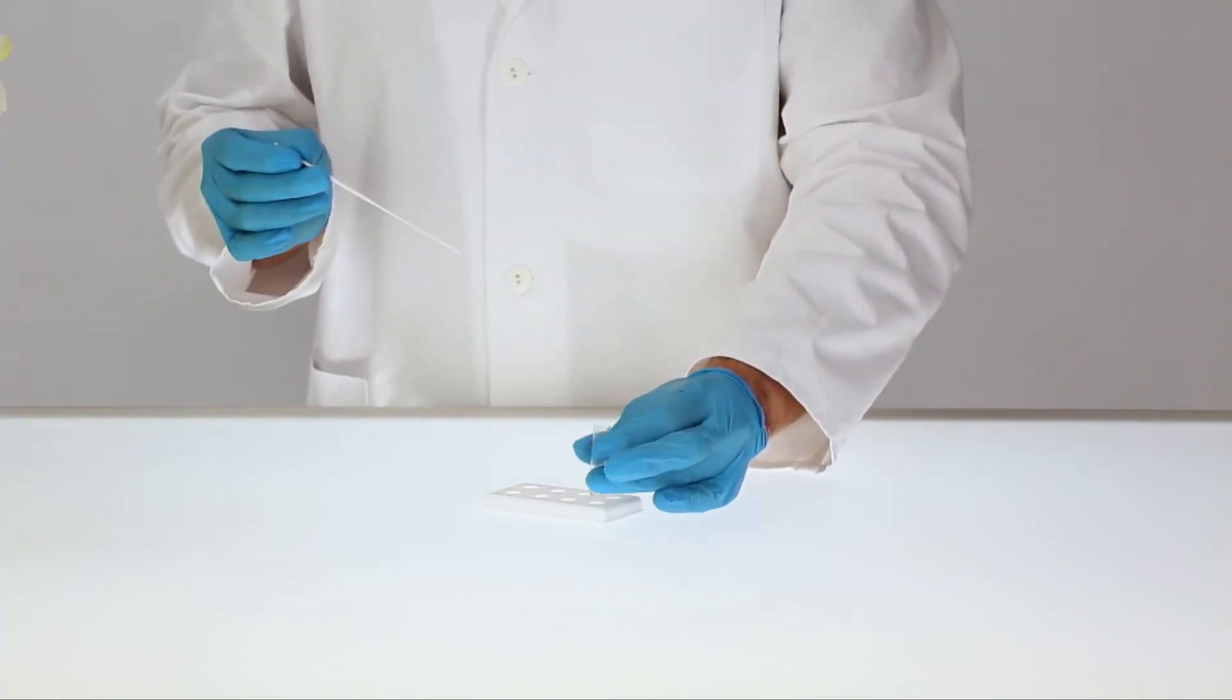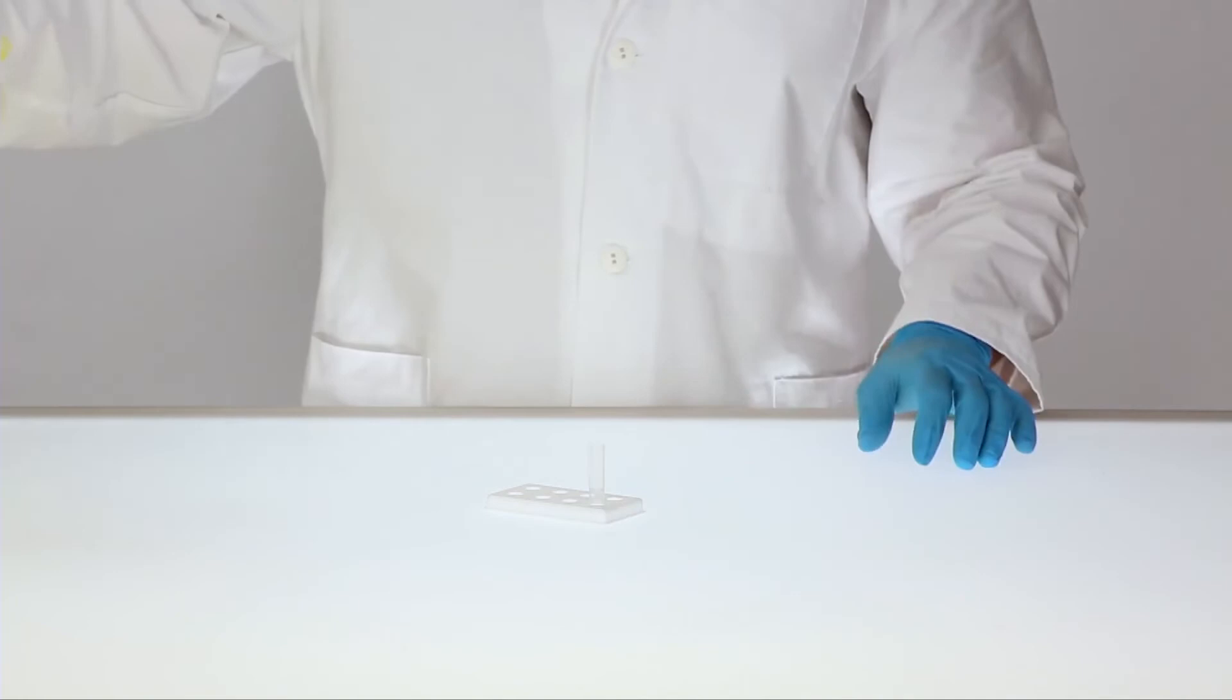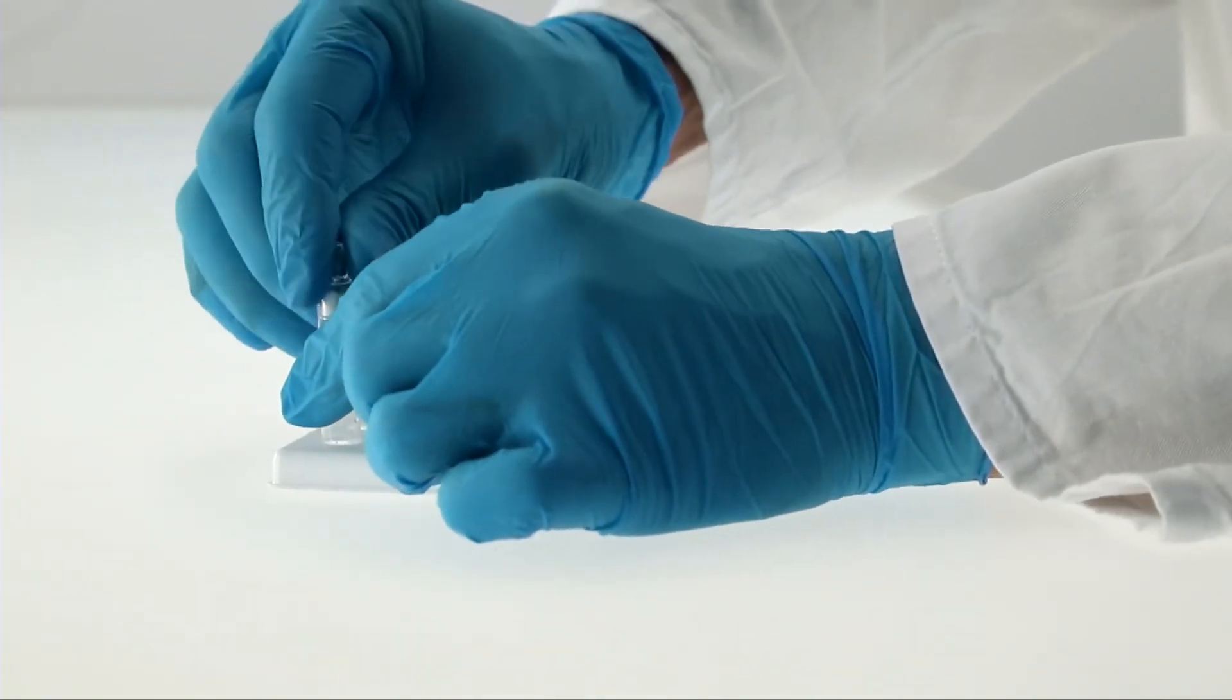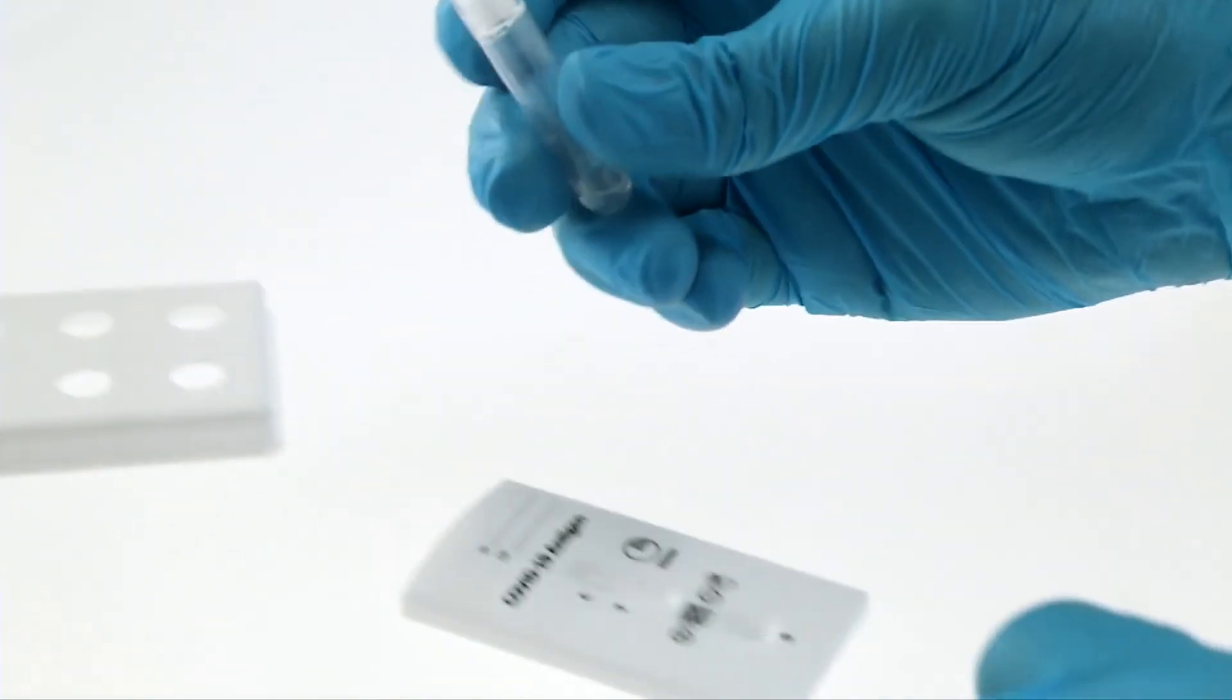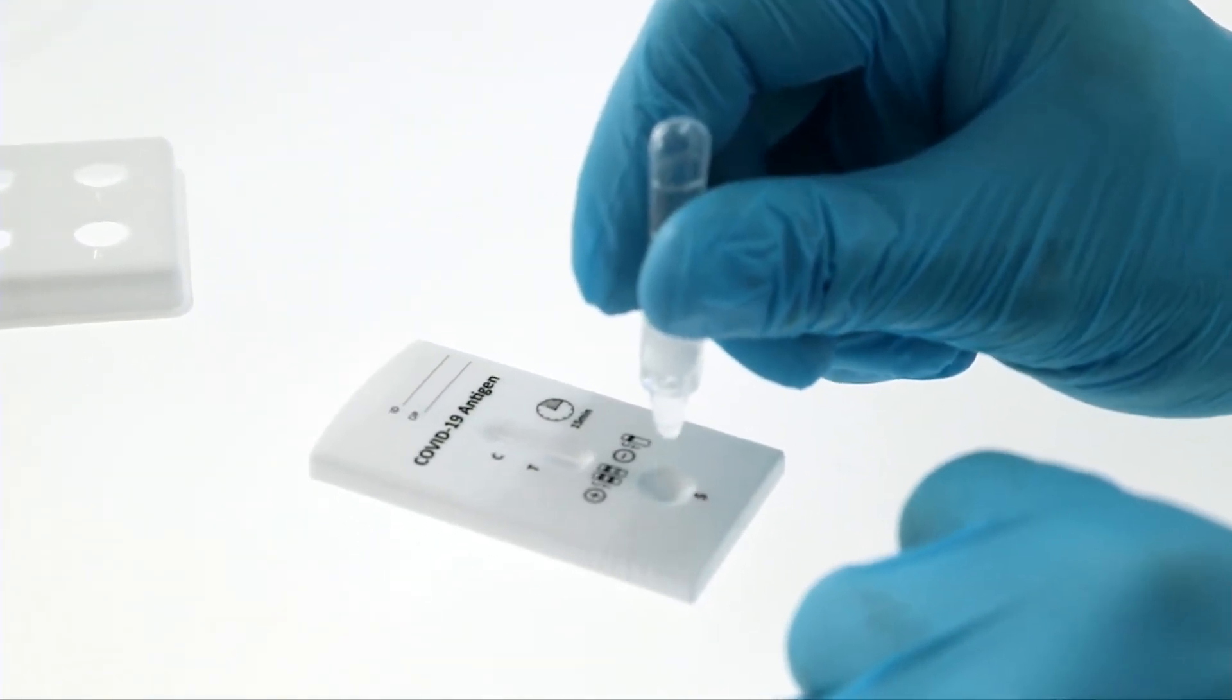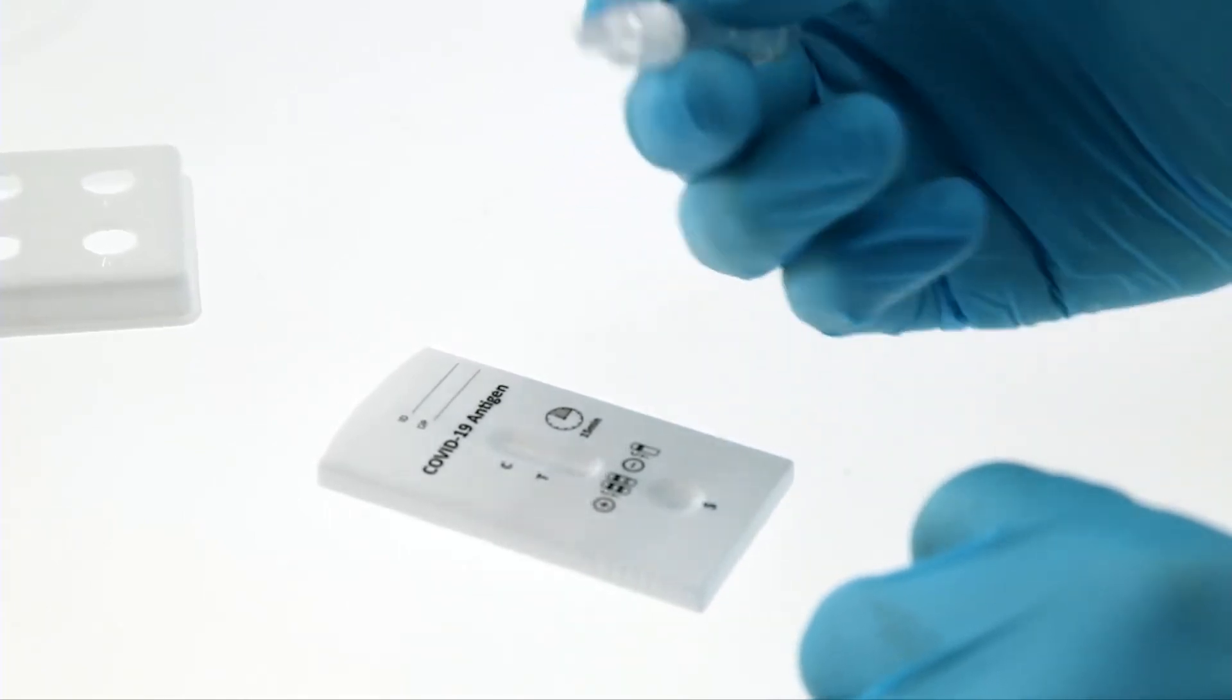When removing the swab, squeeze out as much liquid as possible. Attach a dropper cap to the extraction tube, invert the tube and transfer 2 drops of the extracted solution to the specimen well of the test cassette.